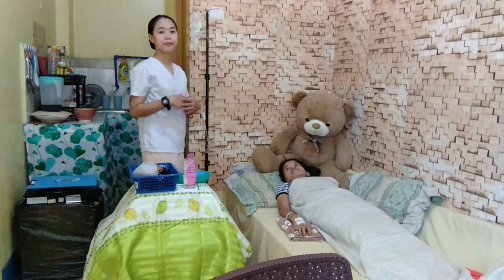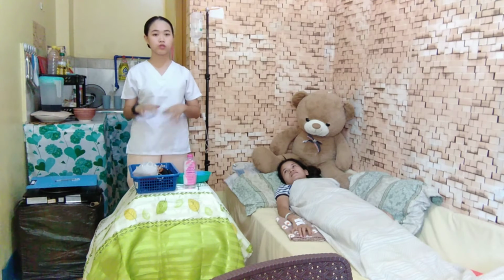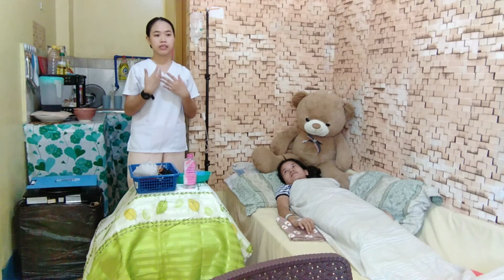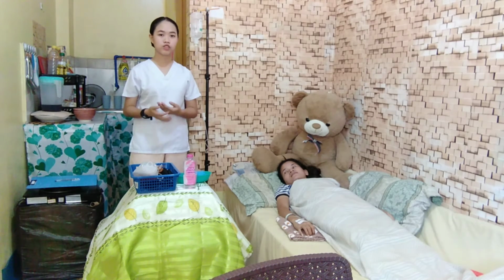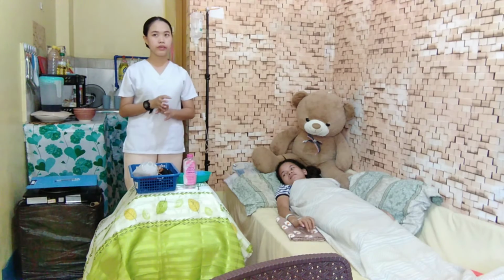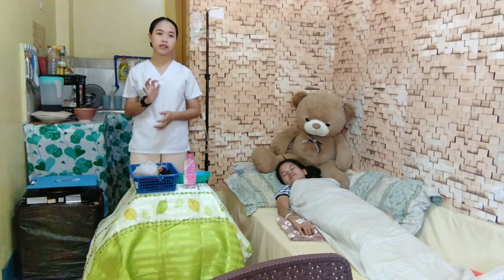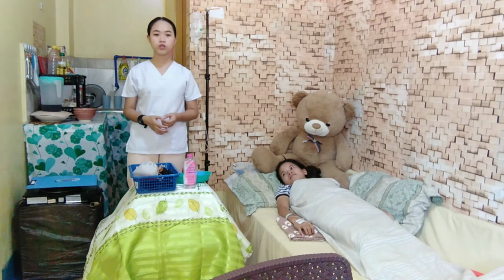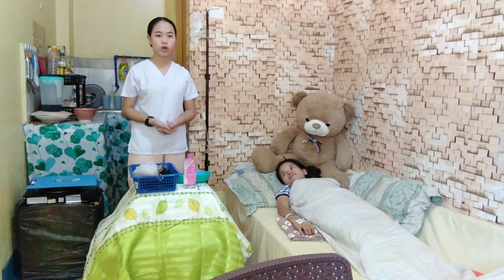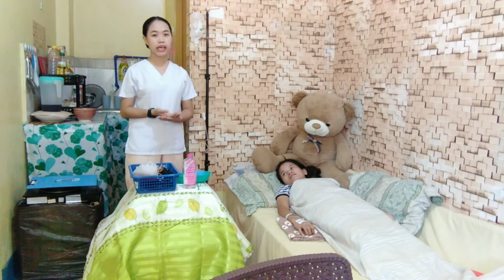So after giving a comfortable position and encouraging the client to empty her bladder, we will now check the cross-match record with another licensed nurse before administration. We will check the ABO group and the Rh type, the client's name, the ID blood band, the hospital number, the expiration of the blood, and also the date.